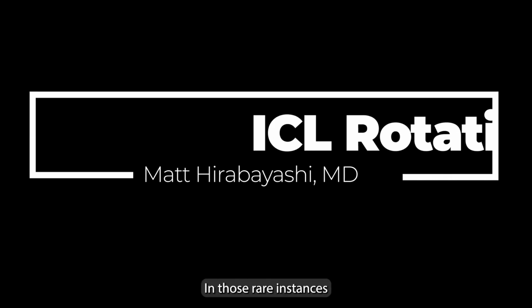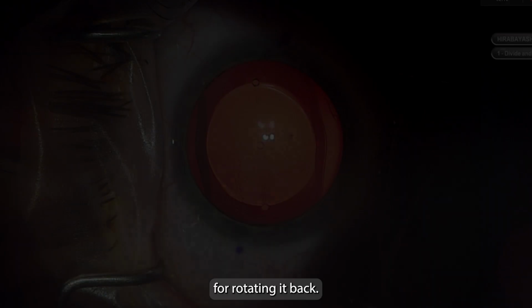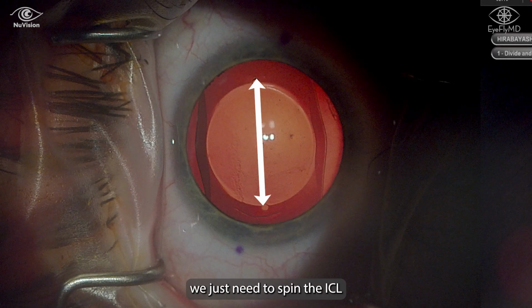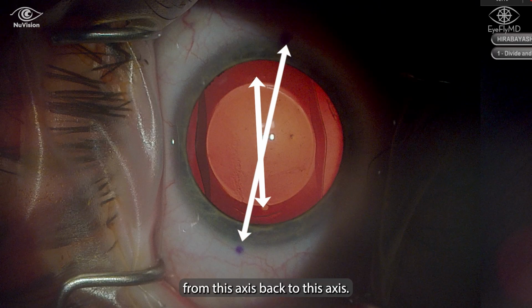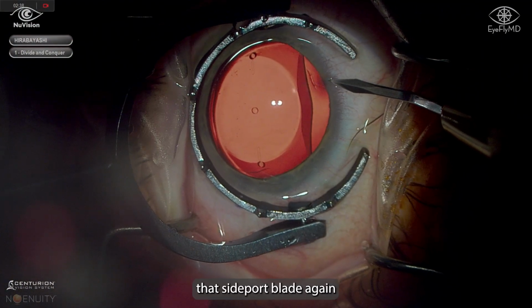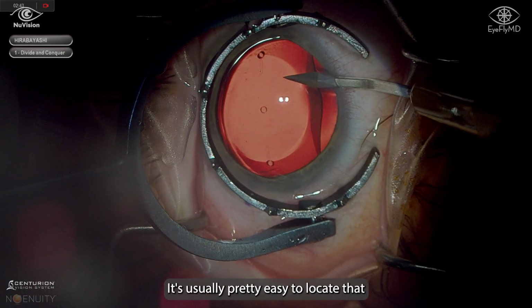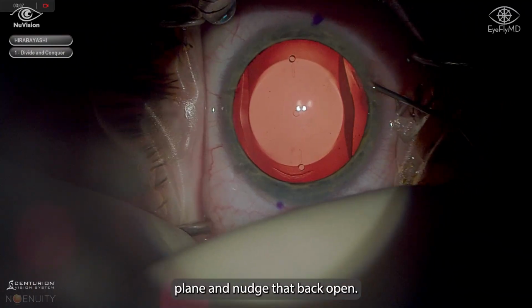In those rare instances that an ICL has rotated, here's my recent method for rotating it back. So in this case, we just need to spin that ICL from this axis back to this axis. It seems to have just rotated a little bit. The way that I do that is first use that side port blade again to find the original plane of the paracentesis. It's usually pretty easy to locate that plane and nudge that back open.